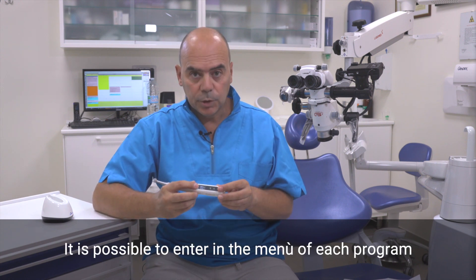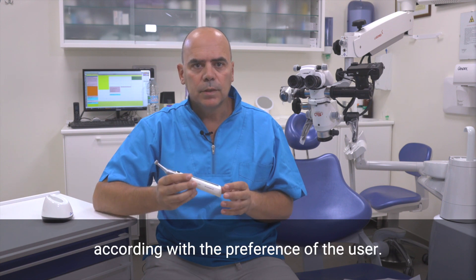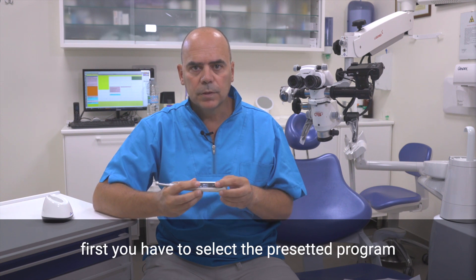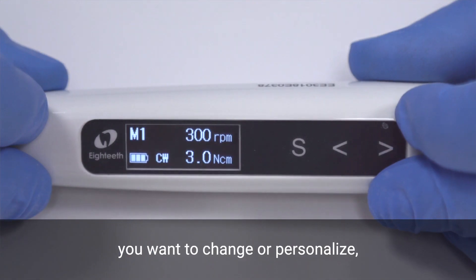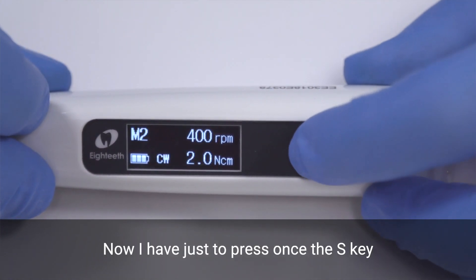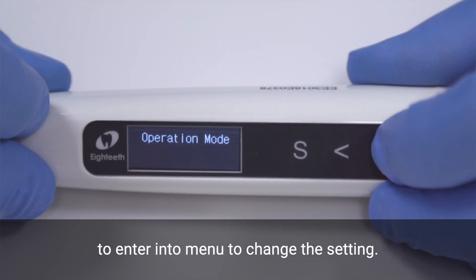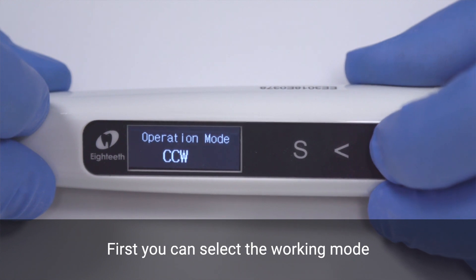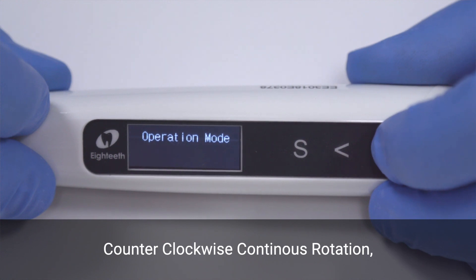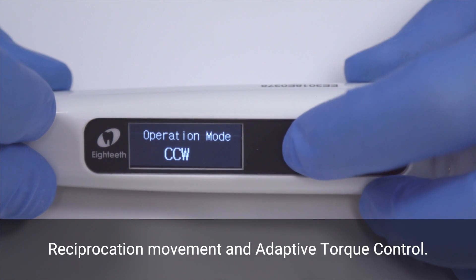It is possible to enter the menu of each program to change the settings according to the preference of the user. It's really simple. First, you have to select the preset program you want to change or personalize. For example, I want to change M2. Press once the S key to enter into the menu. You can select the working mode, choosing among clockwise continuous rotation, counterclockwise continuous rotation, reciprocation movement and adaptive torque control.